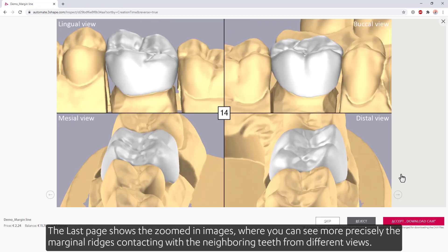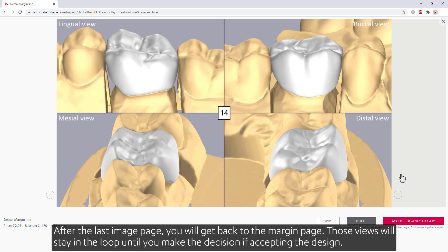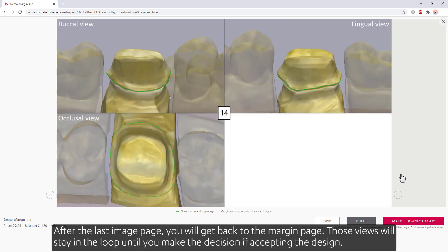The last page shows the zoomed-in images, where you can see more precisely the marginal ridges contacting with the neighboring teeth from different views. After the last image page, you'll get back to the margin page. Those views will stay in the loop until you make the decision of accepting the design.